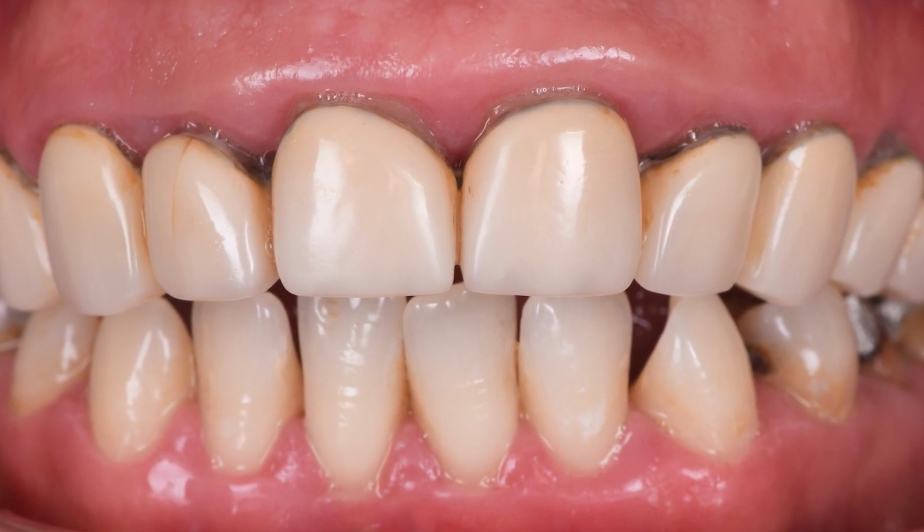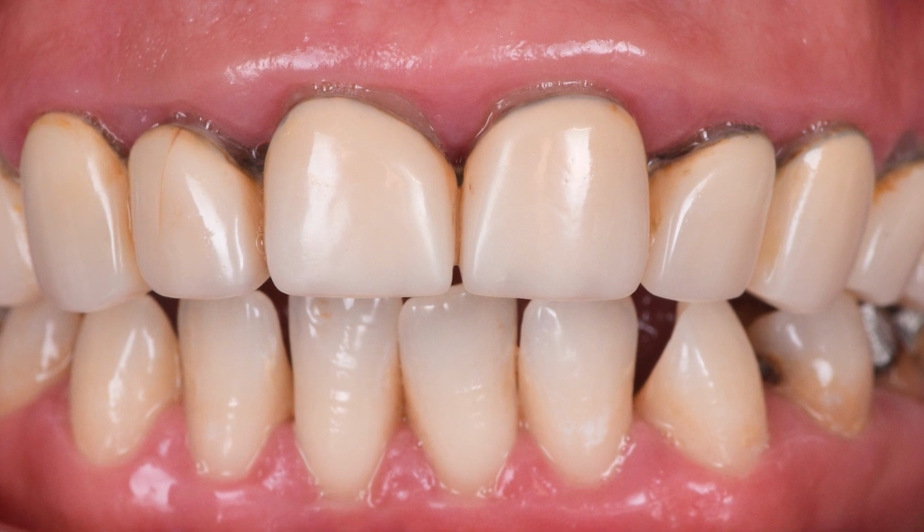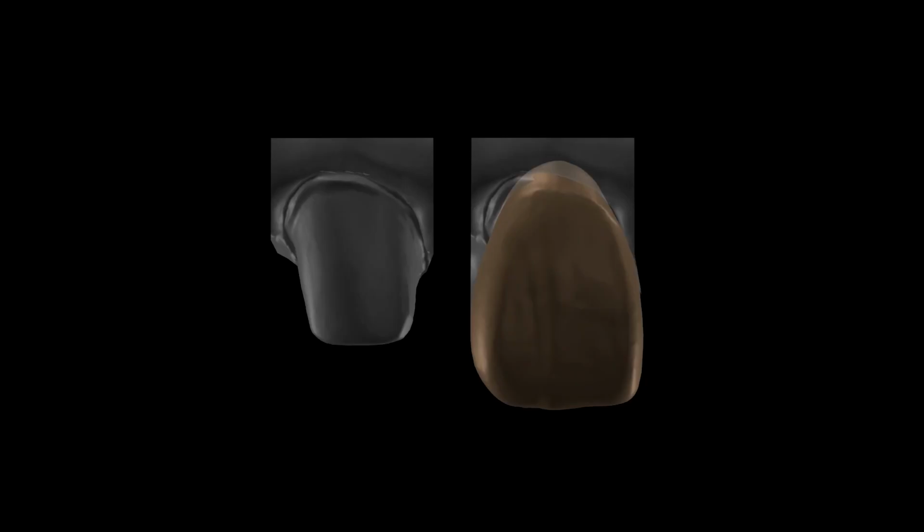When we restore lost dentition, in most cases, we don't have this piece of the puzzle. We don't have the initial shape. Look at this case. There's no initial shape. It has been lost long ago. The only thing we have is a space of possibilities and of libraries we can use within this space. Which means whenever we're going to select any other shape other than its initial, which is long lost, there will be a discrepancy between the prep line and the copy line.